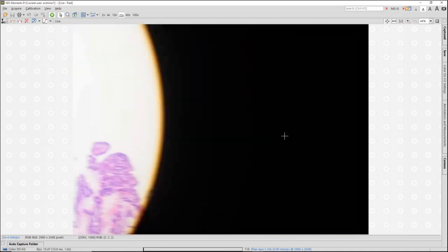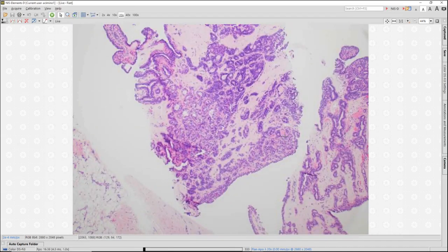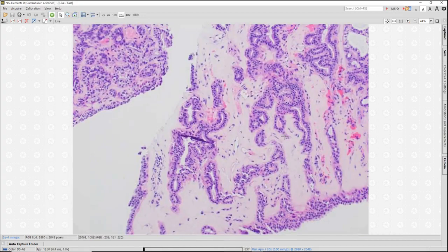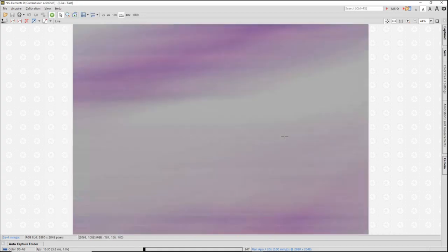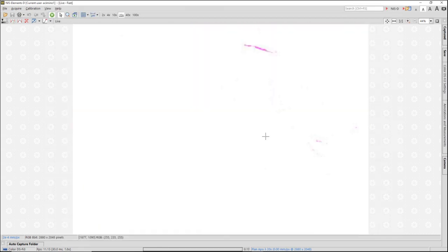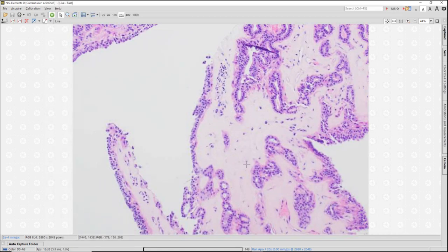So again, as we look at this core here, this fragment of this intraductal papilloma, we see that we have, yes, the surface lining cells are bland, fairly single layer. Let me focus here. Here they're showing a little bit more clear cytoplasm. I have my myoepithelial cell component. I have pink collagenized, fairly low cellular stroma, and then I have benign glands of adenosis within the cores.